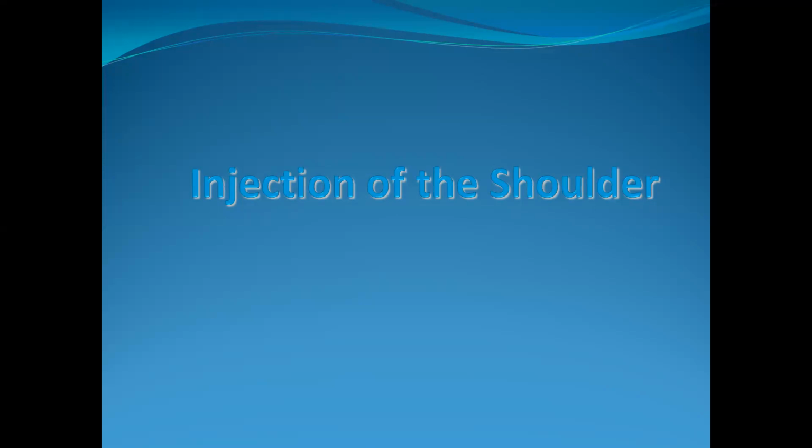If you are dealing with stage 4 osteoarthritis, PRP has no role. So in that situation, if you are aspirating, keep the needle in place. Aspirate the joint, keep the needle in place. Prepare your steroid in another syringe, and with the same needle which is already introduced into the joint, you can inject the steroid. But in case of grade 2 or grade 1 arthritis, the choice is yours.